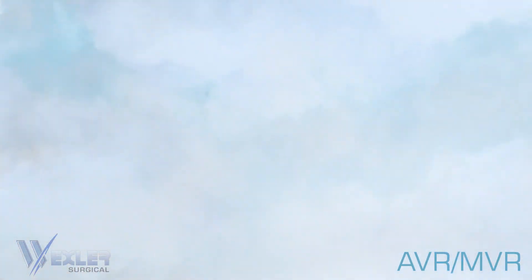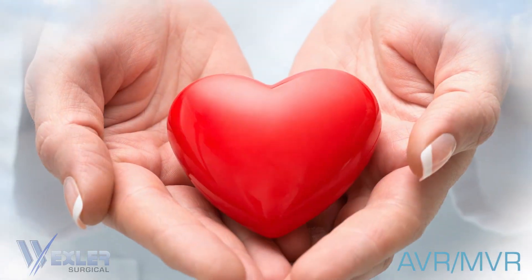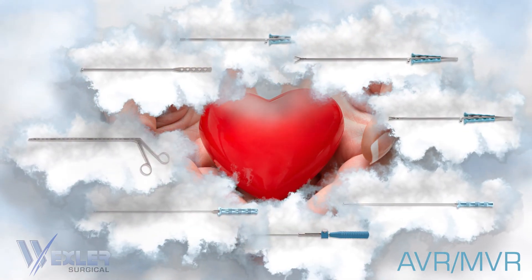The MIS instruments for MVR and AVR from Wexler — a gentle touch in heart care.